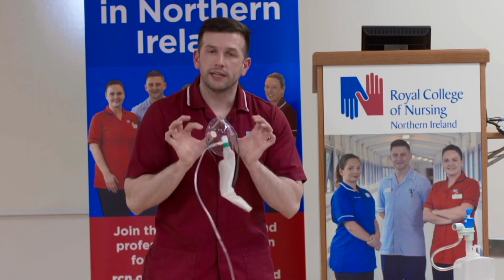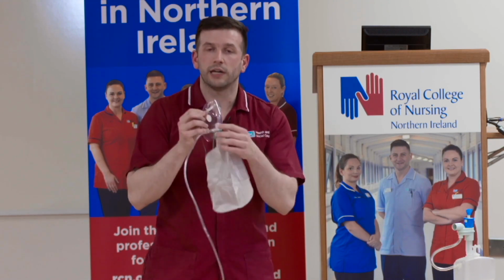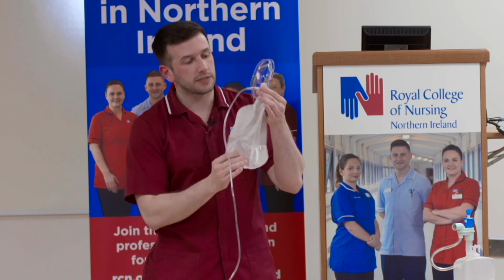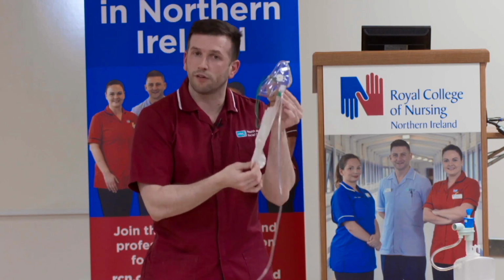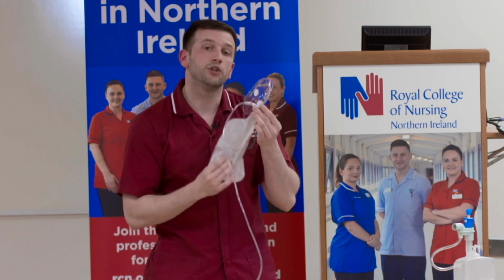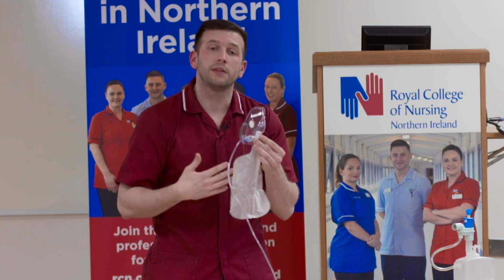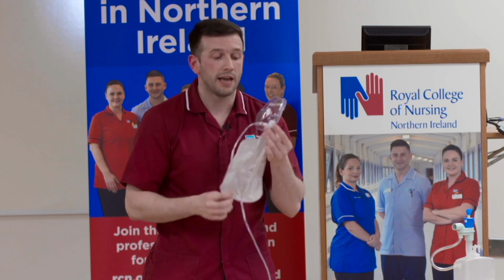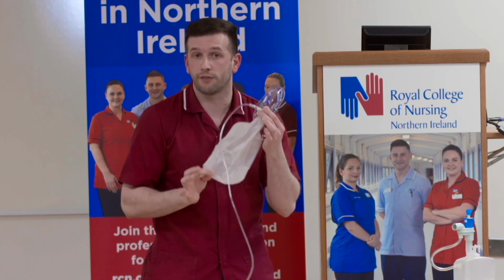When you're monitoring individuals using the non-rebreather mask, it's important that you're able to see a mist coming from the mask, and that with every inspired breath, the reservoir bag depletes by roughly 1/3, and then re-inflates again. The risk is if you don't see the movement of the bag as the patient is breathing in or out, it could be that their inspiratory effort is insufficient and they're at risk of hypoventilation. That in itself can be an early marker that your patient has deteriorated further.